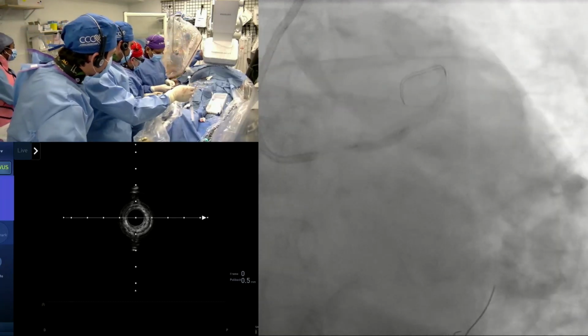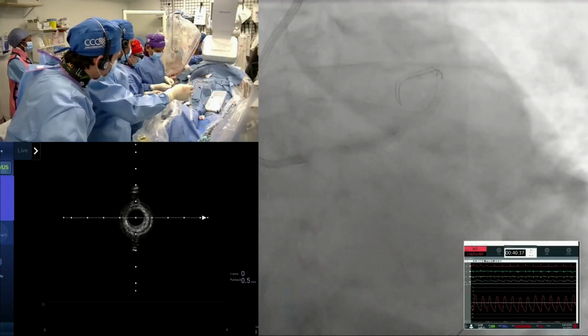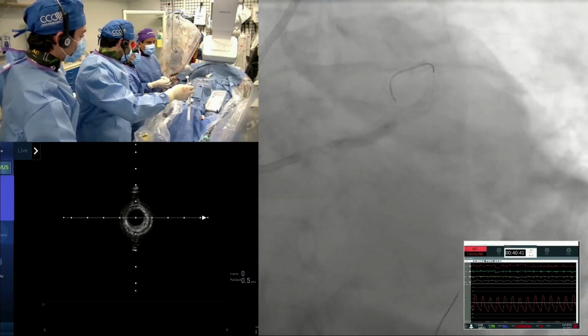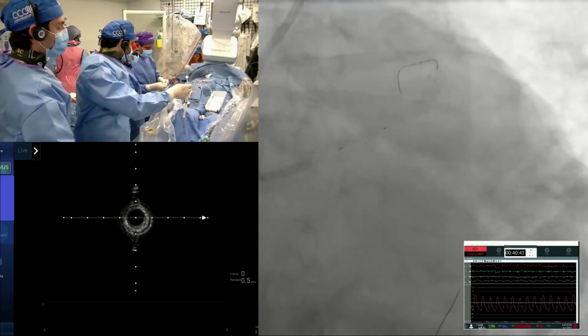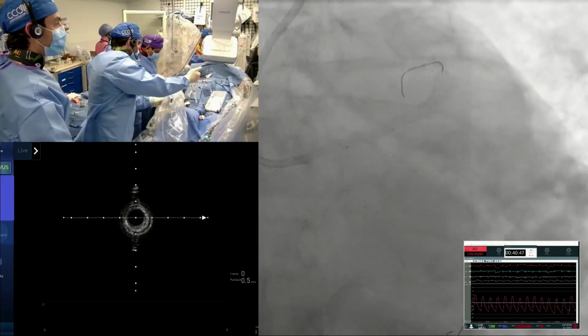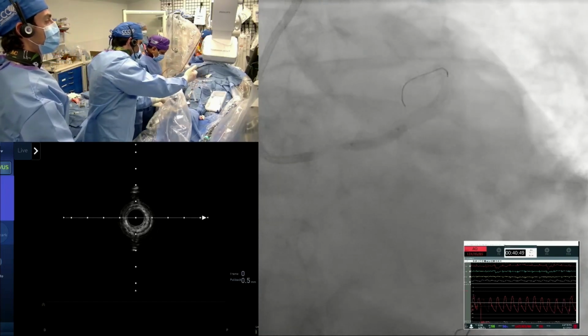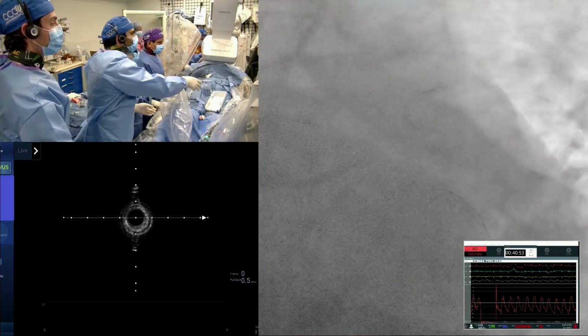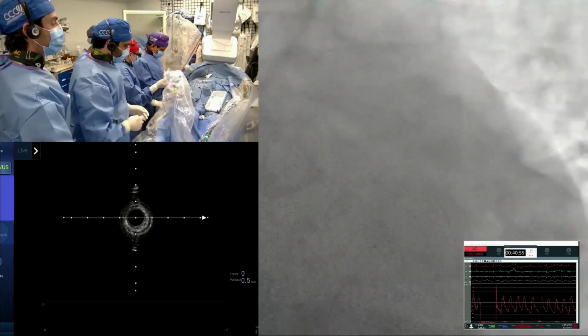Right, Kiski? How many cuts did you see? Not like a clear cut. So if you didn't see a clear-cut fracture, that's the strongest reason to, I think, use the IVL. Yeah, it looks like the 2.0 just made a tunnel of exactly 2.0. 2.08. It was pretty circular exactly where the IVUS team showed us this cross-section.